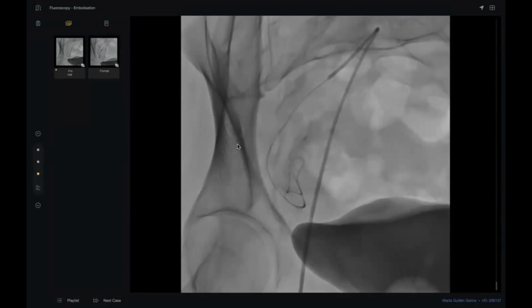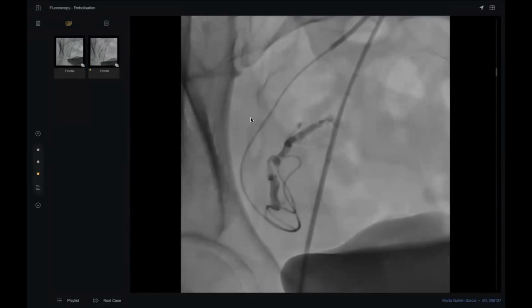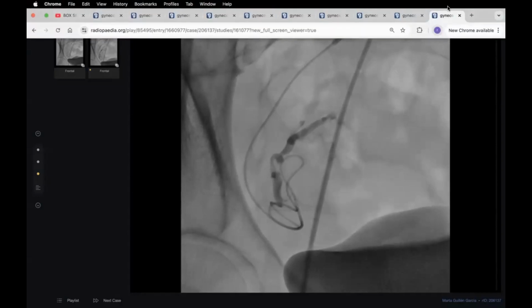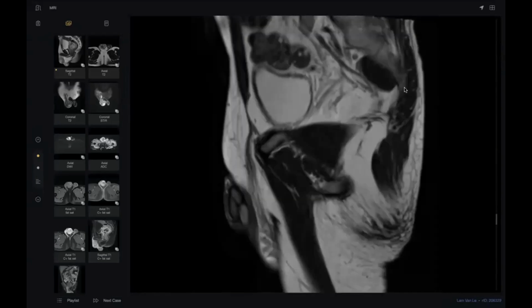Complete obstruction of the AVF. Yes, they occluded most of it. There is no vascularity seen. Okay. By the way, for rapid emergency bleeding, they can use gel foam. Gel foam. But this is for life saving. Thank you, doctor, so much.